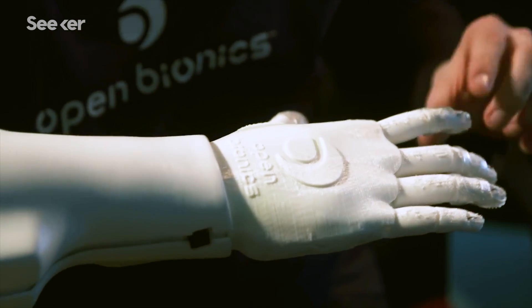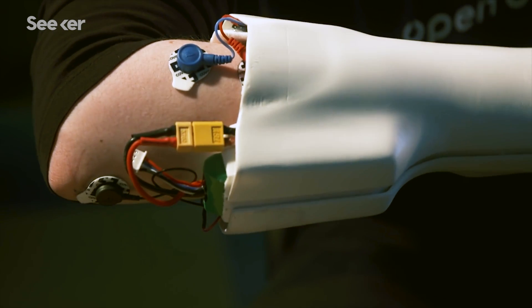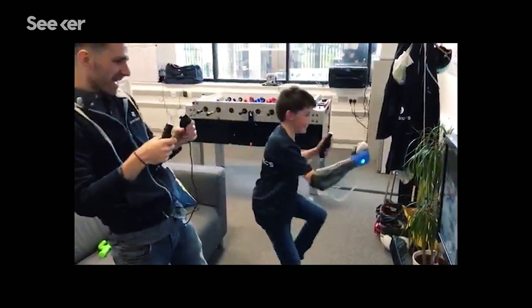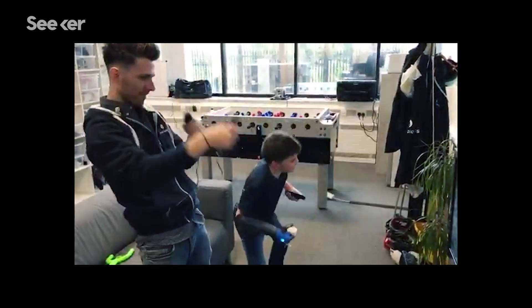One of the really cool things about the Hero Arm's design is that it has adjustability built into the socket, so it can cope with a little more growth than usual. That means that as a child grows, their prosthesis can grow with them.